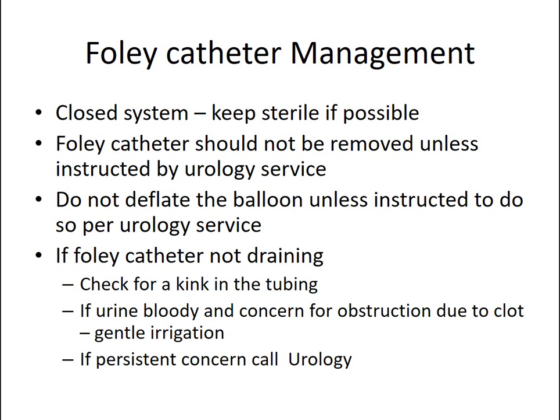How do we manage Foley catheters? I think this is just a brief overview of some of the salient features regarding Foley catheter management. It's a closed system, and the goal is to keep it sterile as much as possible. A Foley catheter placed by the urology service should not be removed unless instructed by the urology service. Again, if we do a complex bladder augmentation, and particularly if we were to affect the outlet of the bladder and the catheter is removed, we may not be able to get it back in.